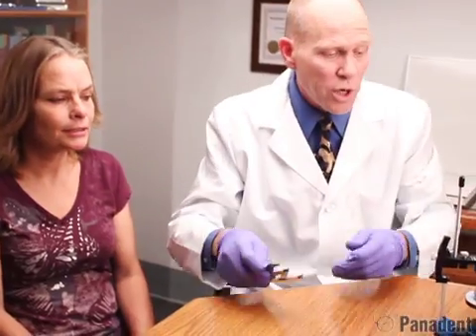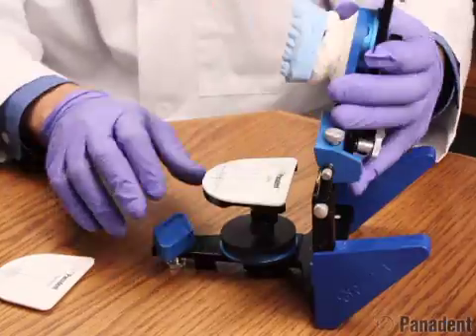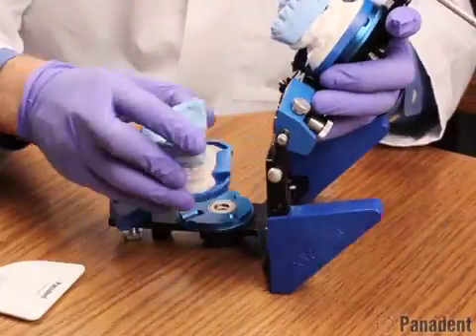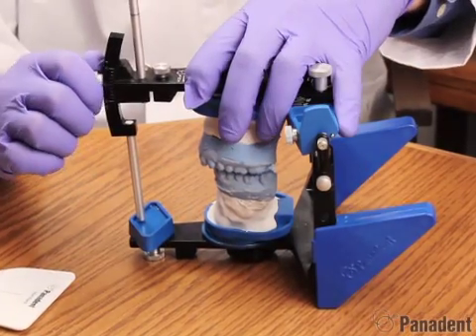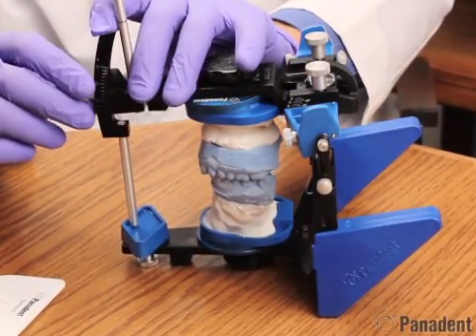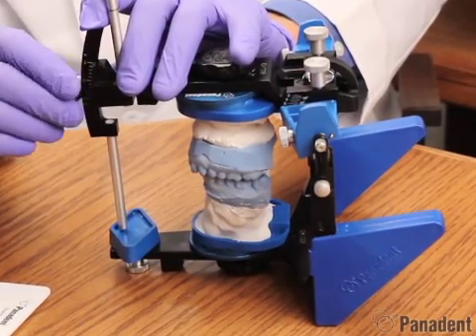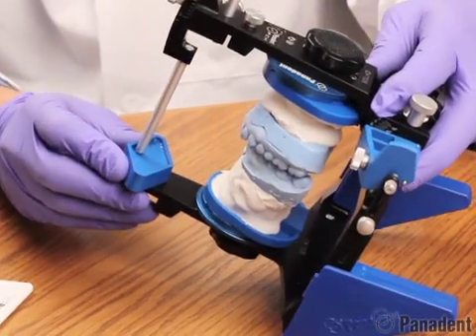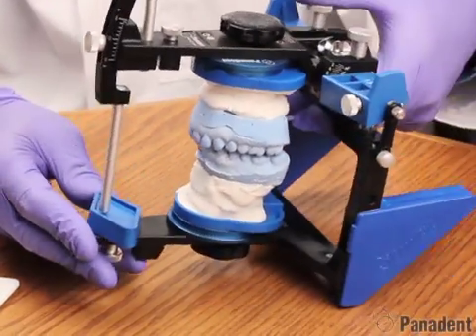If you did want to change the vertical dimension of occlusion, you'd have your upper cast completed so we can remove the platform. You can add the lower cast and then drop it down until the teeth occlude. If we want to increase vertical dimension two millimeters, we could raise the pin up two millimeters and the technician could wax in the lower teeth against the upper teeth, completing the case.